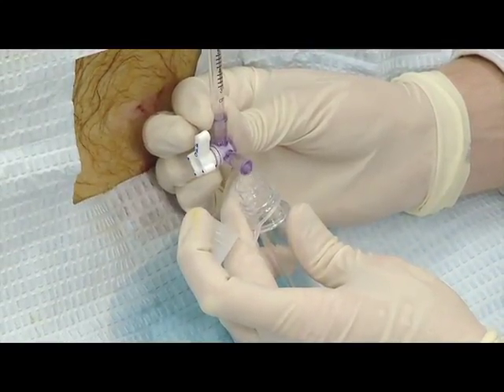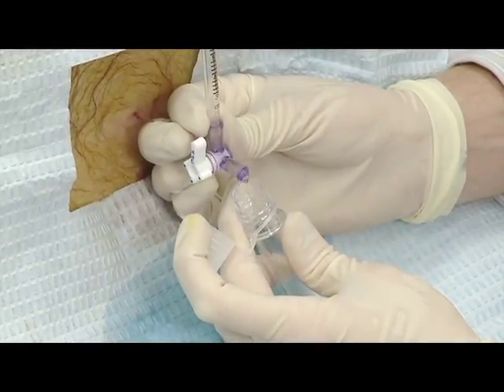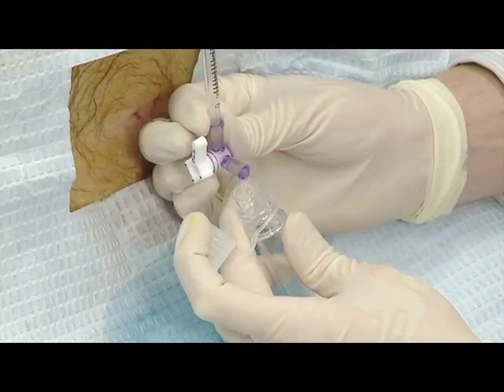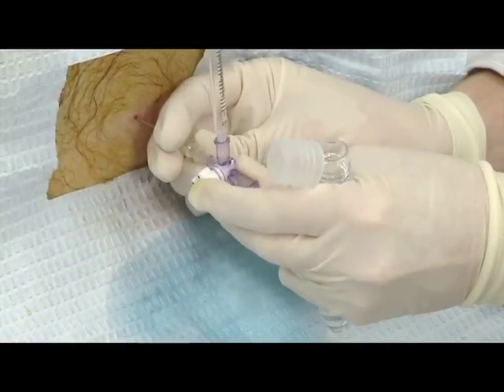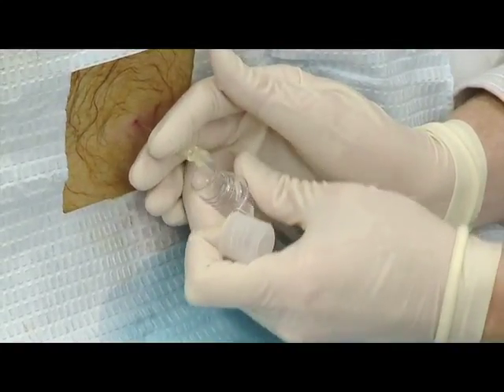Normal adult pressures are 100 to 180 millimeters of water. Pressures greater than 200 millimeters of water reflect elevated intracranial pressure. Detach and set aside the manometer and allow the fluid to drip directly into each tube.